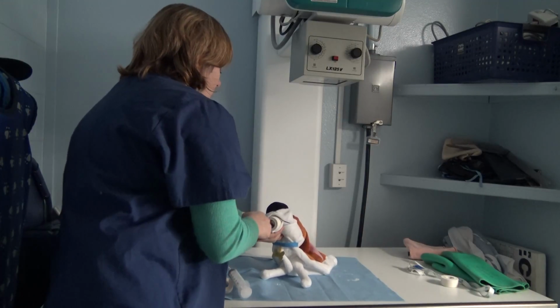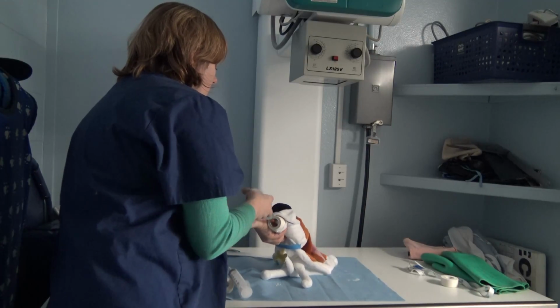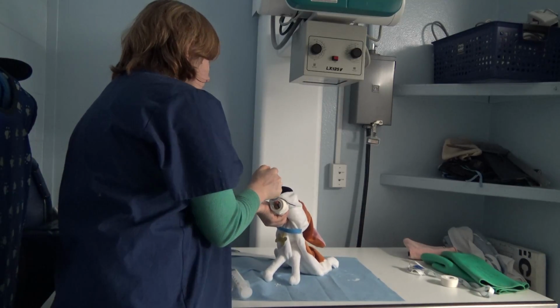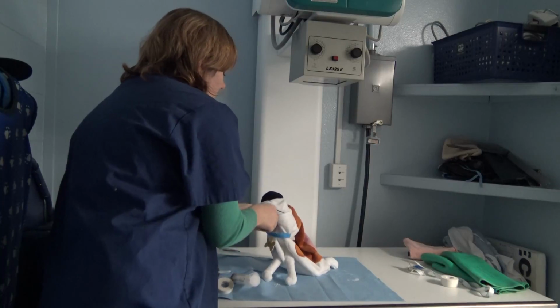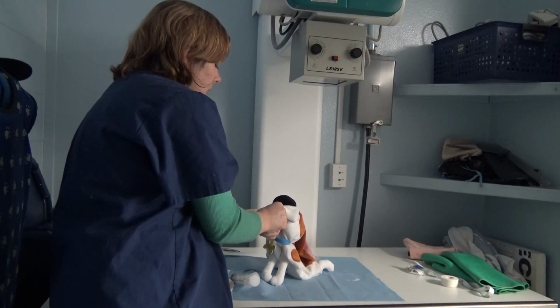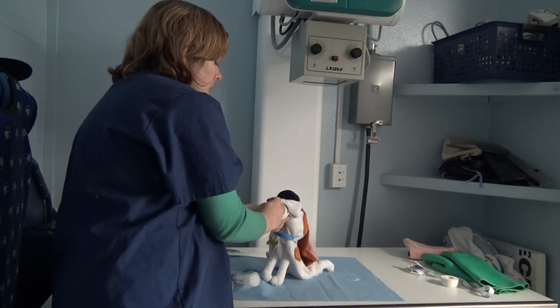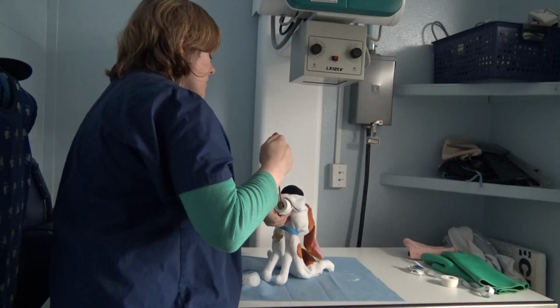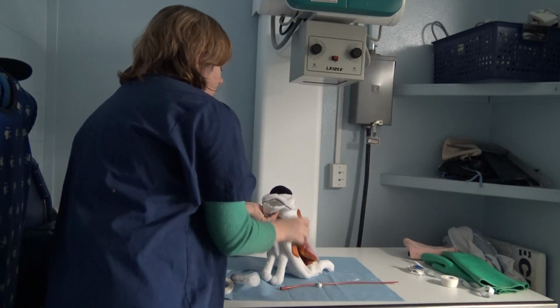We're going to follow up with a few mils of water. Now that our barium is in the patient, we're going to go ahead and gently hold the end and gently pull out the tube. We're going to take out our mouth gag.